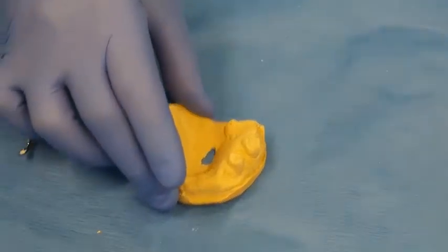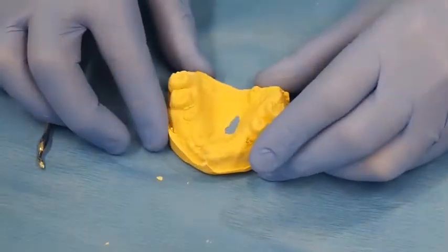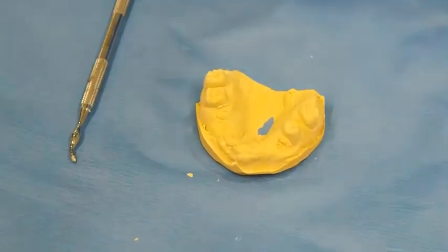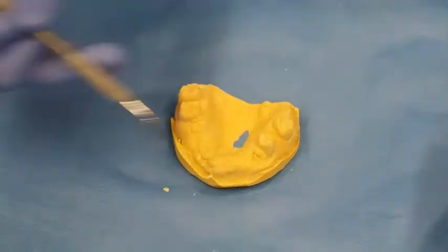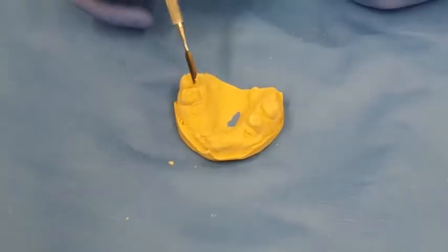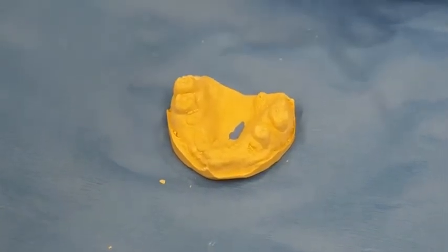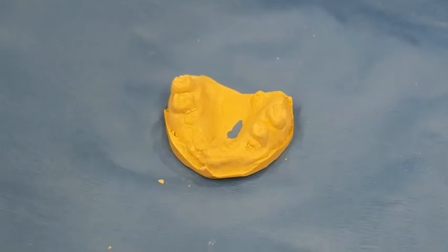And let's go first on this upper arch, right? You can see it well right there, right, Wally? Mm-hmm, yeah. Okay. So for this situation here, there's not much we can do about this. And let's pretend these three or four remaining teeth have class 4 mobility and severe periodontal disease, right?